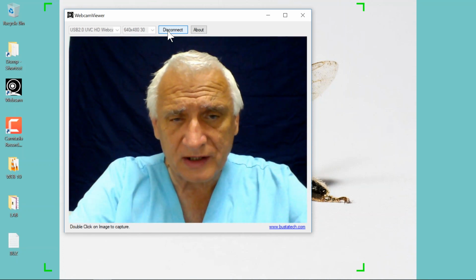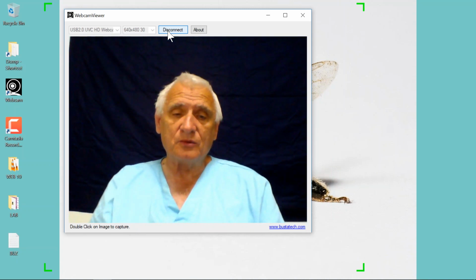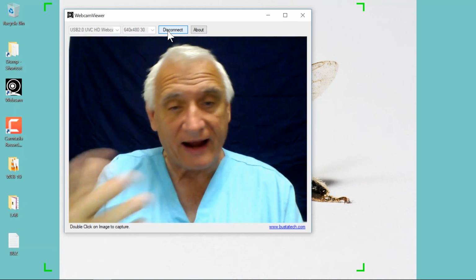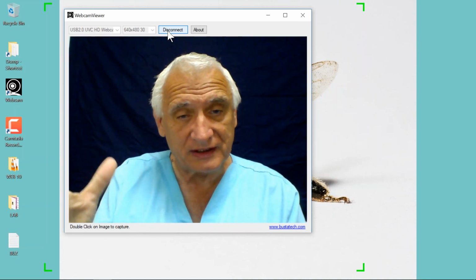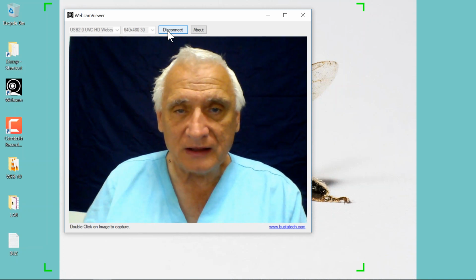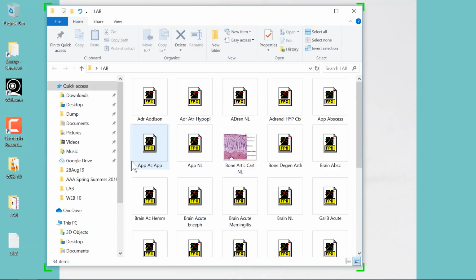Maybe I'll ask some questions. They will sometimes be rhetorical questions, but anything you want to say when I show you the slides, like if I say, does the cell look dark? You could say yes or no. It doesn't matter. It will help me know if I'm actually showing you the things that I hope to show you. So let's drop the ugly guy, and rather than putting up a PowerPoint, let's actually go to a slide.